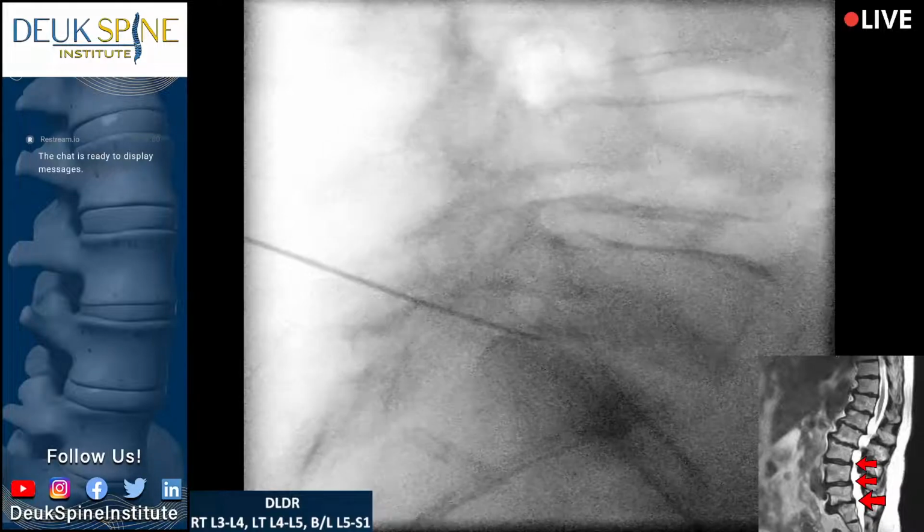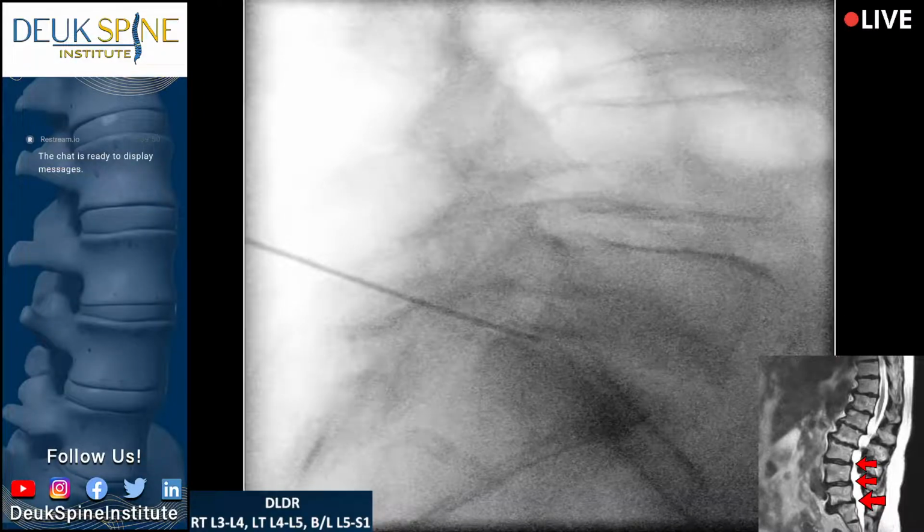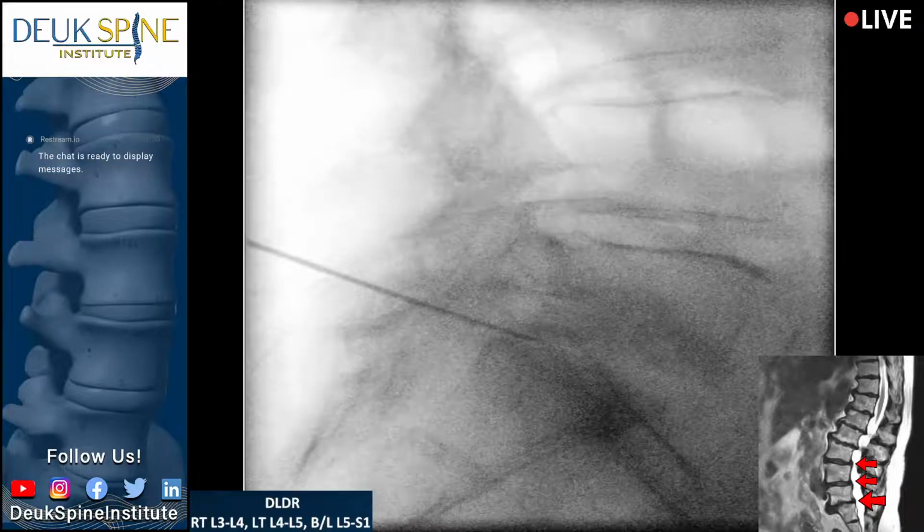Where do you feel it? Sweetheart, where are you feeling the pain? Where in your leg? Tell me where. We should be well below her nerve root. Left leg. How far down your leg, sweetheart? Halfway, knee, or all the way to your toes? All the way down.